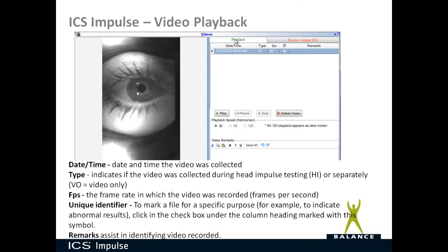You have what frames per second were selected for that video recording. You have a unique identifier. So to mark a file for a specific purpose, for example, to indicate abnormal results, or this is data that you want to use for a research project, click in the checkbox under the column heading marked with this symbol. And I'll show you where that shows up in your patient list.